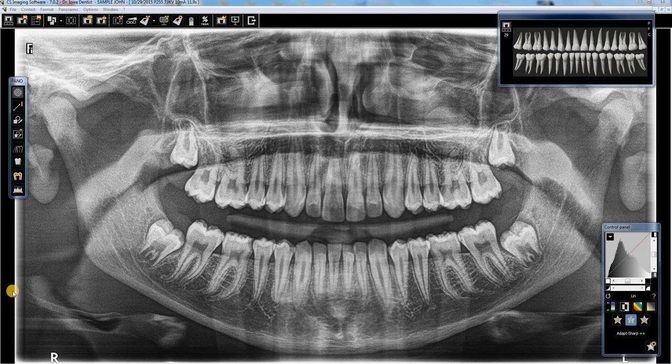Once we get our panoramic images taken, as you can see here, we've got the dental imaging software. It's going to be a little bit different in Win OMS imaging and the imaging software from OrthoTrack. But in dental imaging software, once we have the panoramic up, we will have our control panel here.